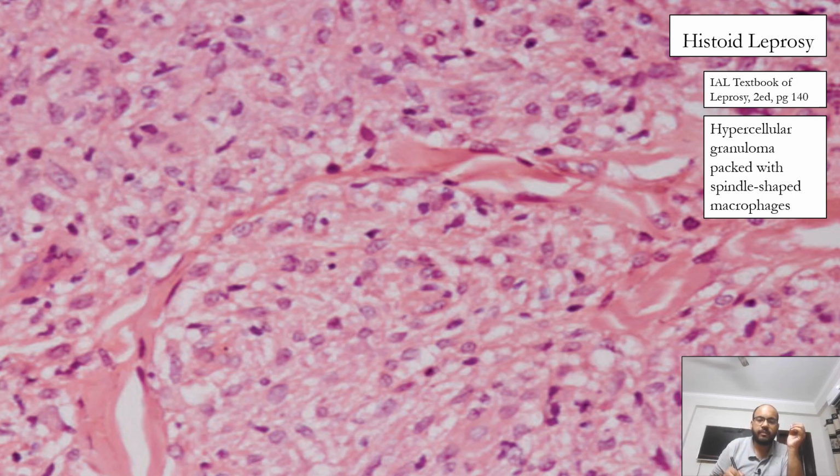In this slide, if I have to point out, you can see some of the flattened cells which are darkly staining as compared to epithelioid cells, and these are nothing but spindly cells or spindle shaped macrophages. The macrophages become spindle shaped, and you can in fact see a pseudocapsule, a fibrous pseudocapsule. Okay, so they grow so fast that they compress the surrounding tissue and form a pseudocapsule. Let me just remove the marking so that you can better appreciate the pseudocapsule. Clear? Any doubts regarding histoid leprosy, mention in the comments and I'll answer it. Okay? Let's move forward.